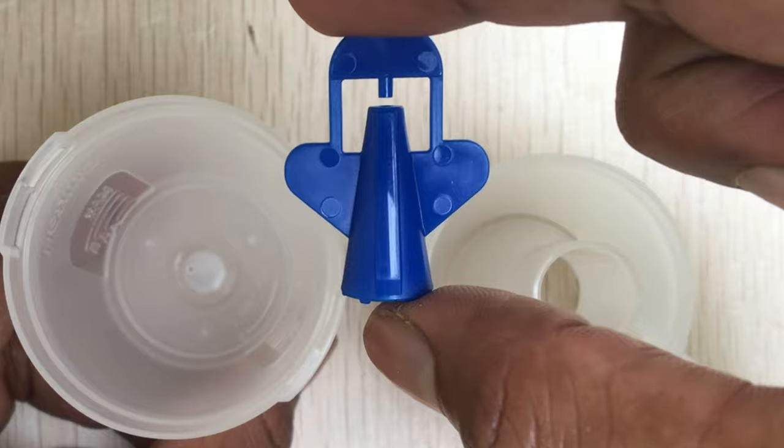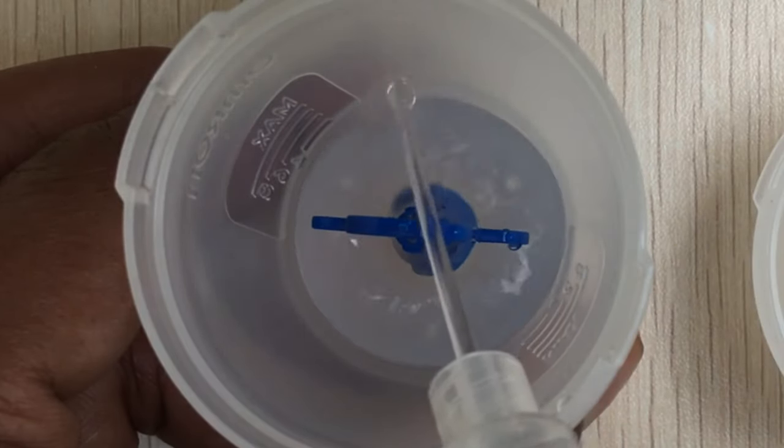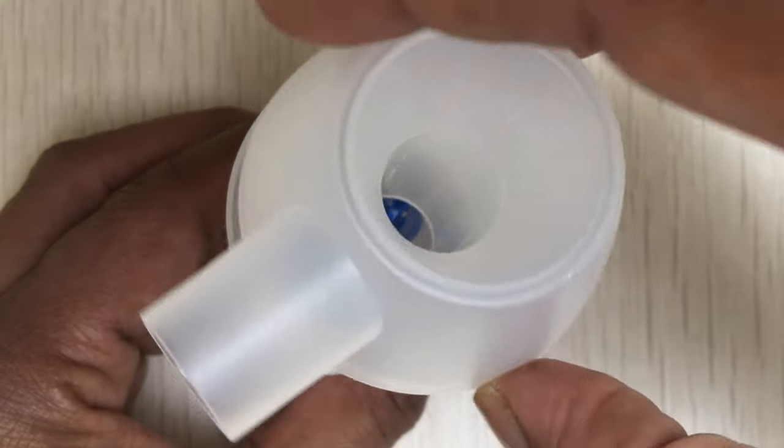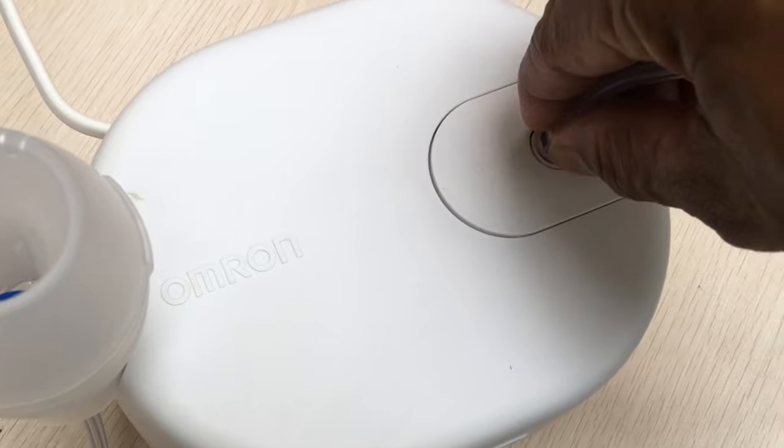Make sure the vaporizer head is placed inside the tank and add the correct amount of prescribed medication. Put the inhalation top back onto the medication tank.